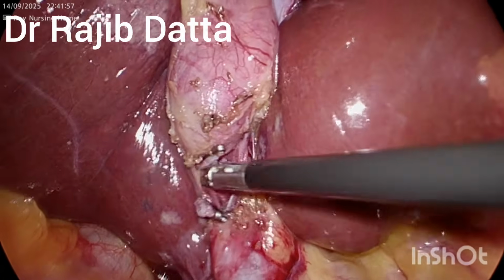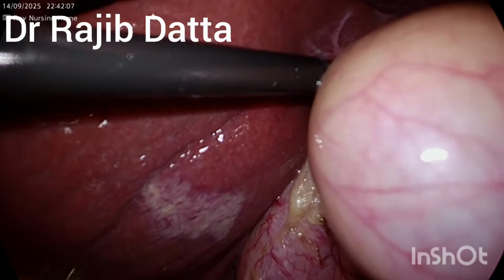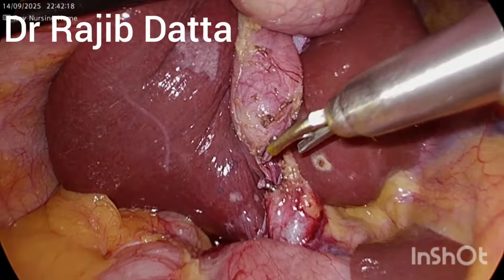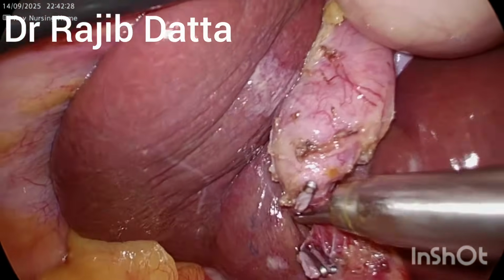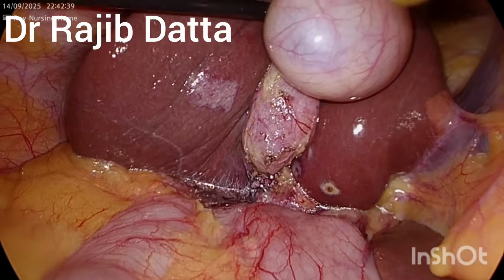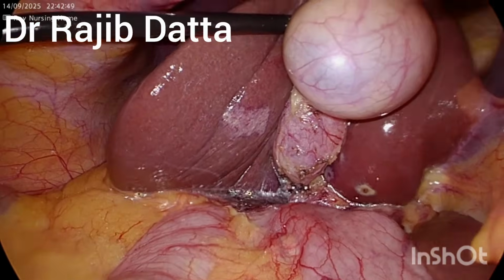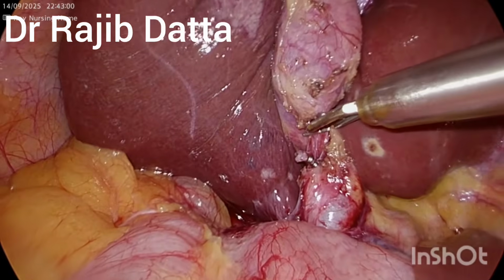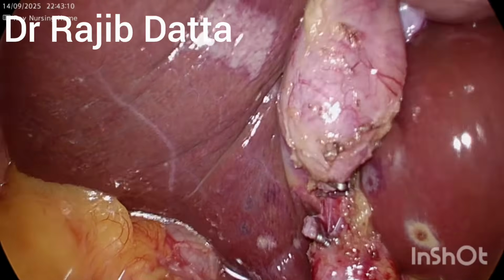For this the Maryland forceps is an excellent instrument for proper delineation of this luminal structure within the fibrofatty tissue. The 300 Liga clip has been applied, and another 300 Liga clip will be applied along with the previous one, and we will separate the cystic artery with the help of the bipolar hemostatic forceps. So two 300 Liga clips have been applied here.